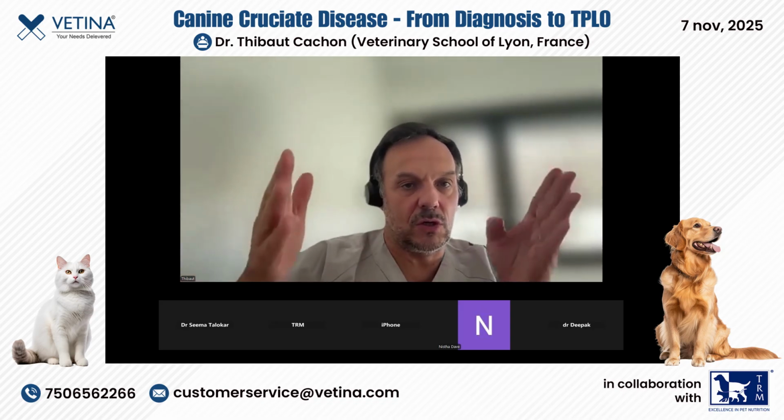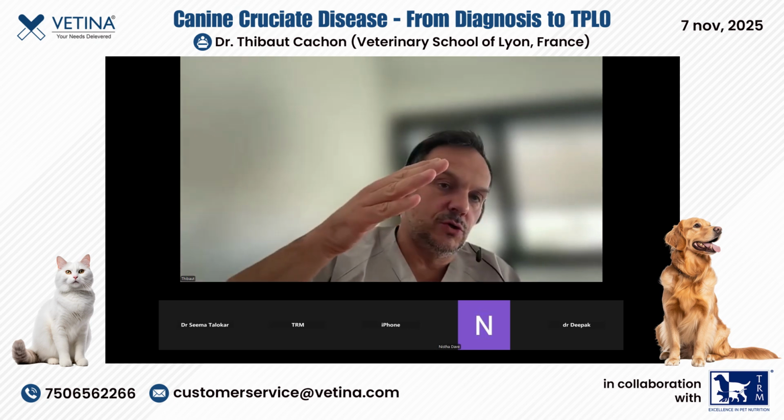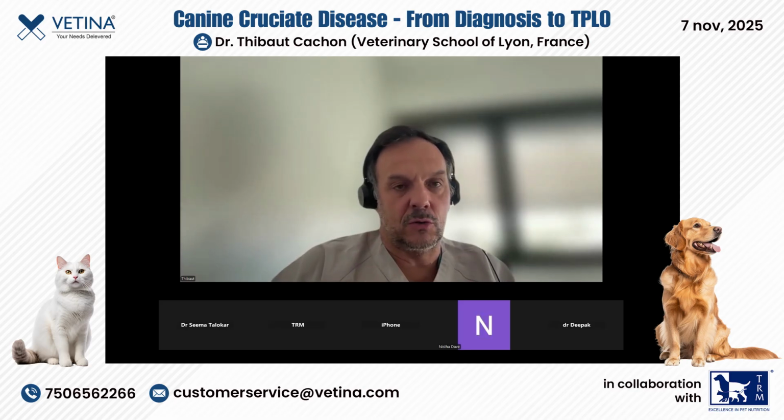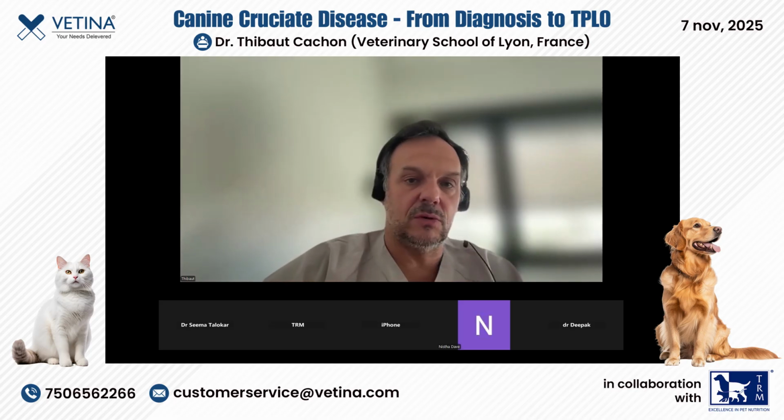You can do the surgery in dorsal recumbency, but you can also put your dog in lateral recumbency to do your TPLO. But for the stifle exploration, I always put the dog in dorsal recumbency, and then you can move just after the arthroscopy to the lateral side.